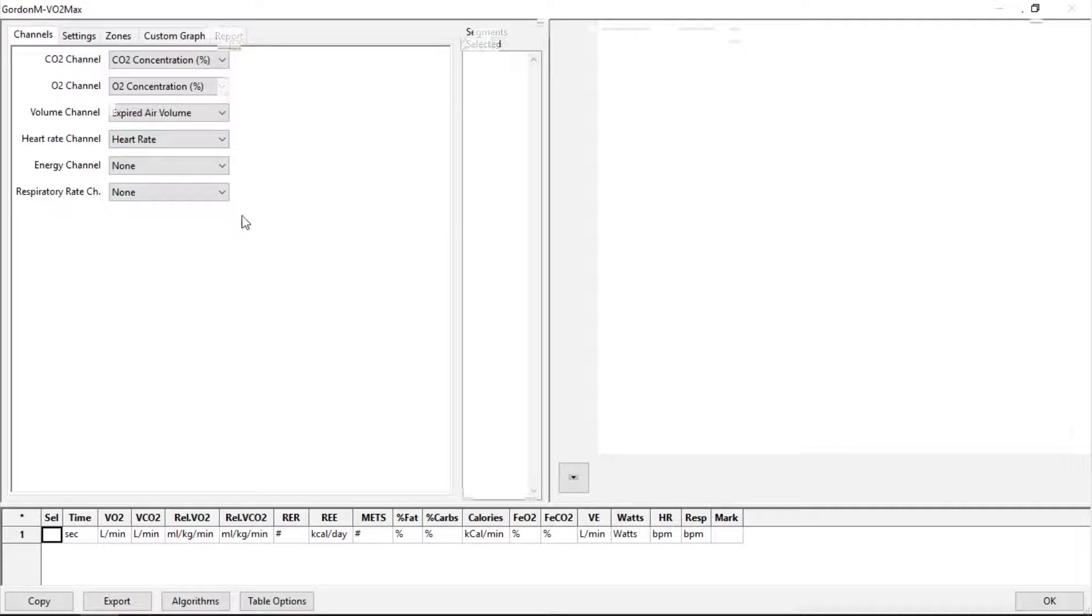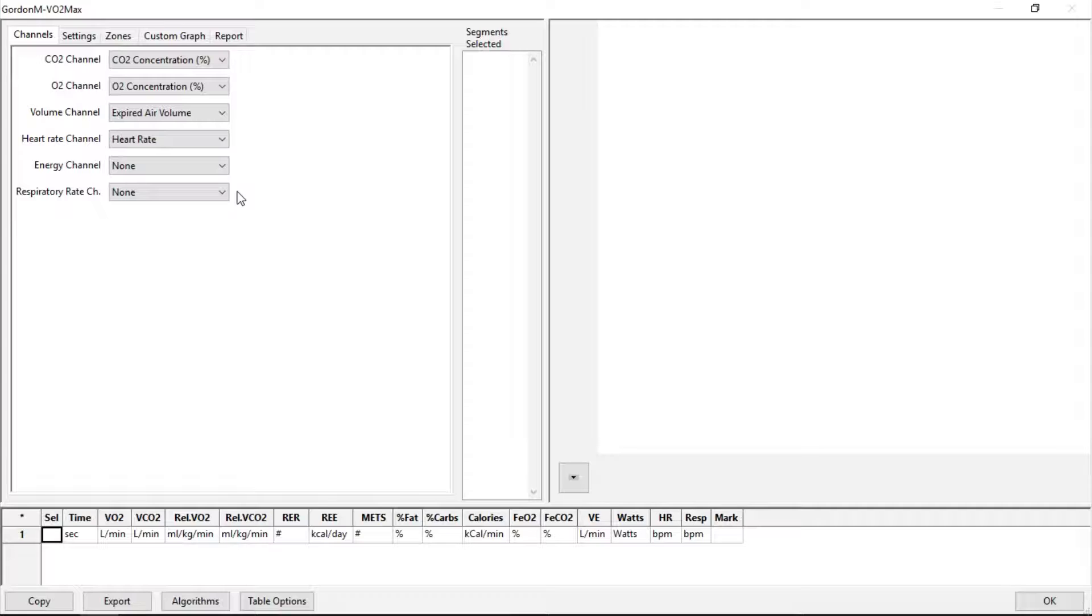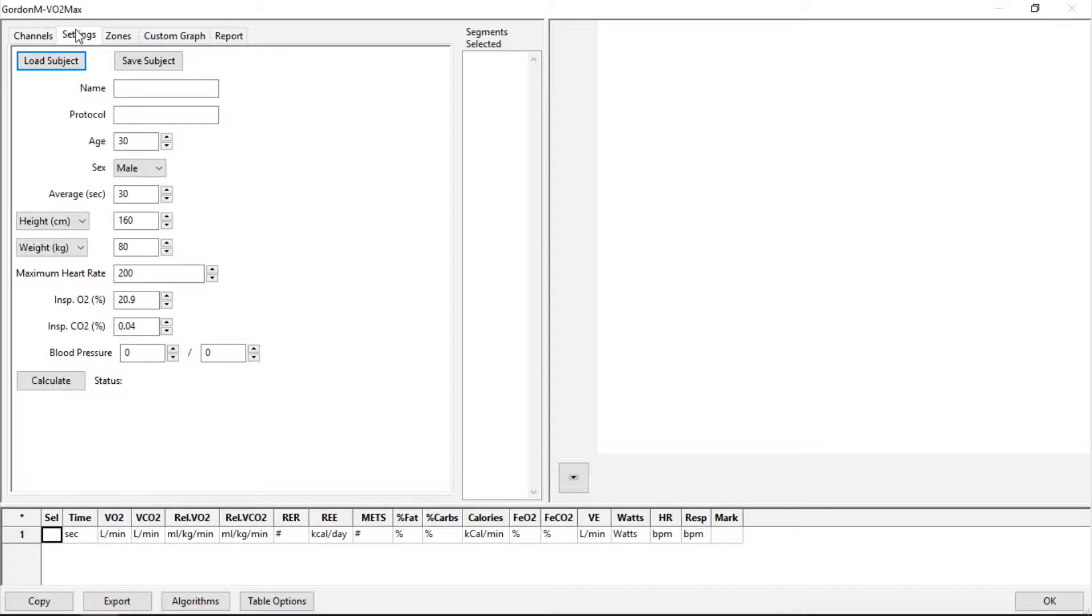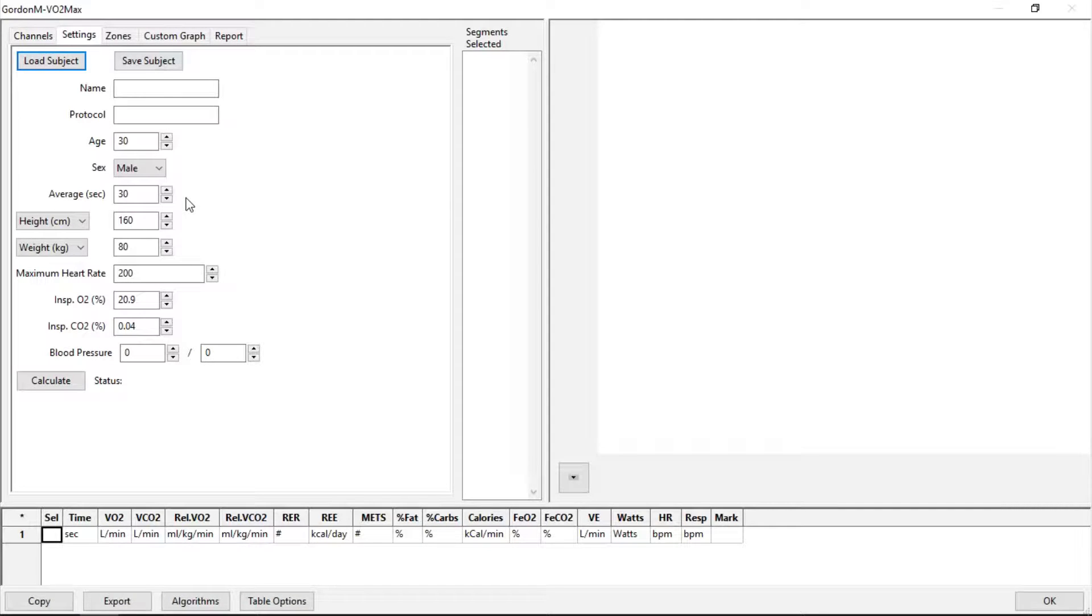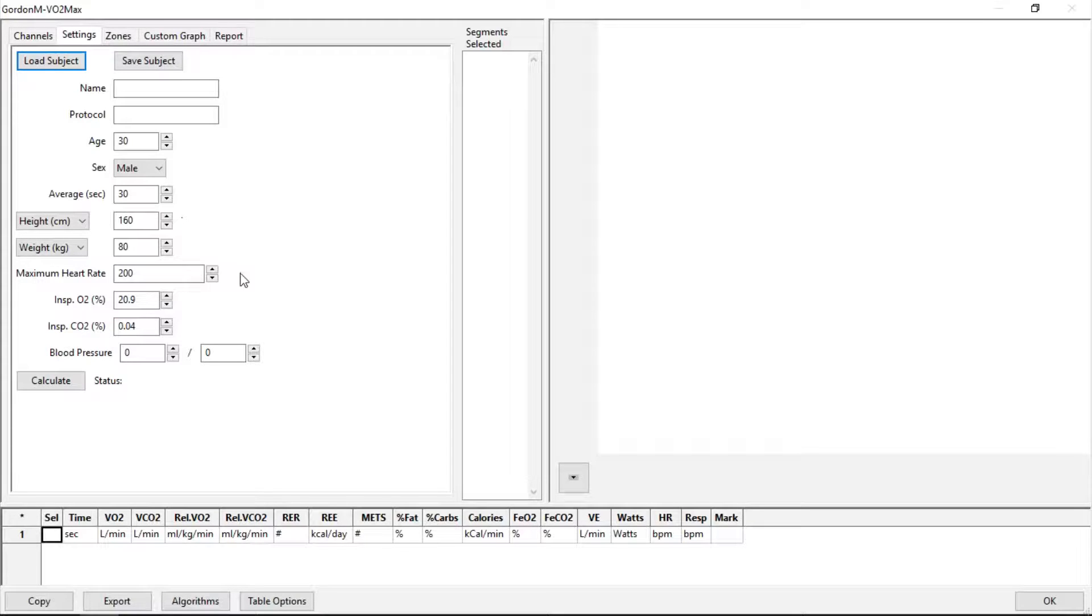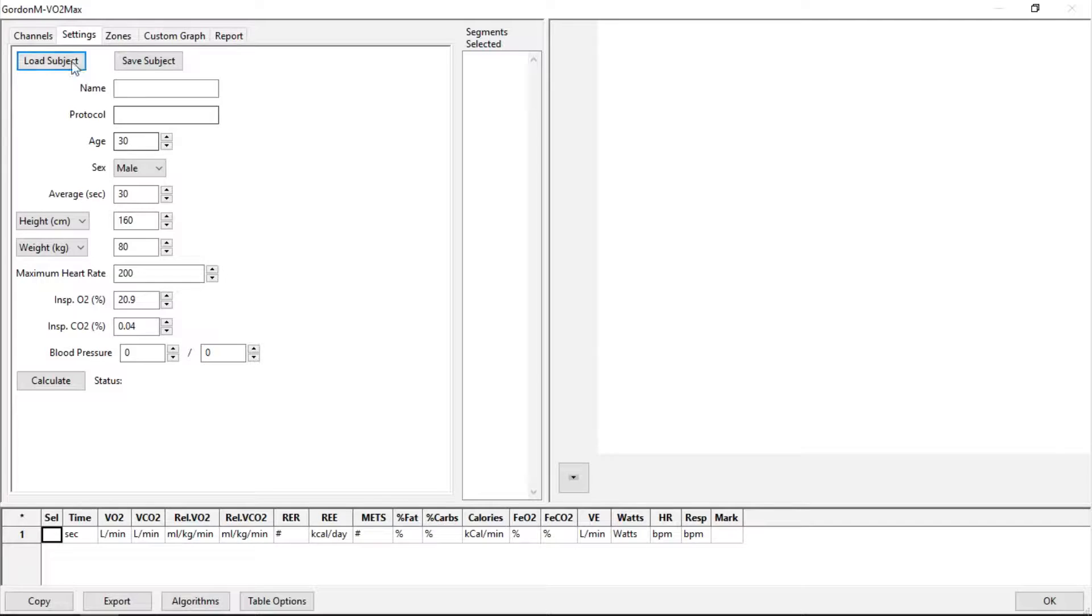You can set an energy and a respiratory rate channel if you have those as well. Under the settings tab, you can put the individual's name, the protocol, their age, their sex, how often we want to calculate, their height and weight, a maximum heart rate, inspiratory O2 and CO2, as well as a blood pressure. We can save a subject, but we can also load one. Let's do so.